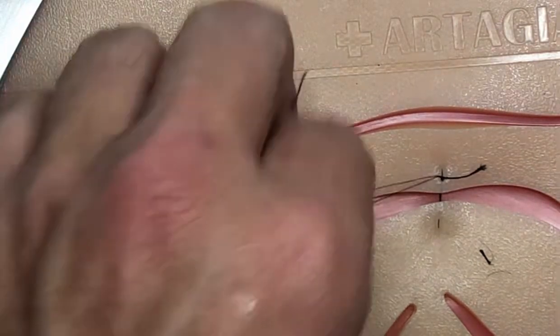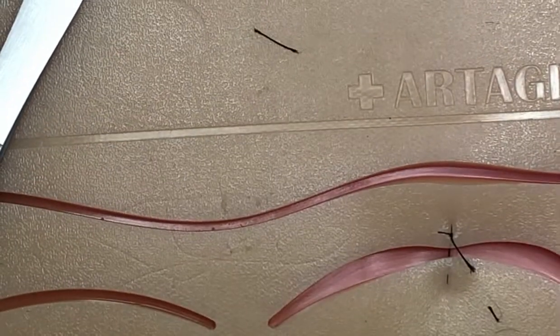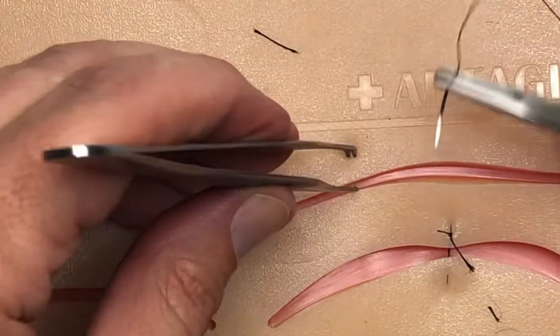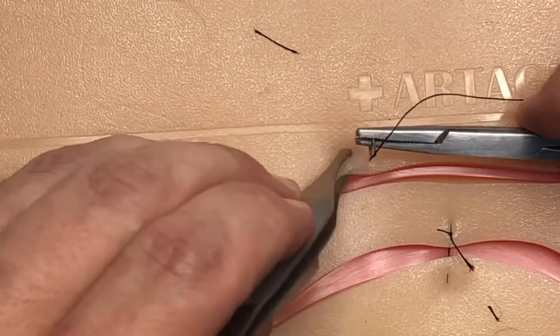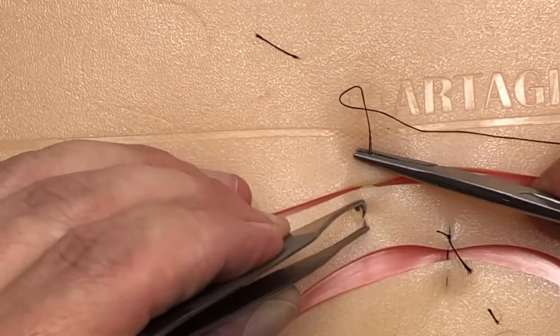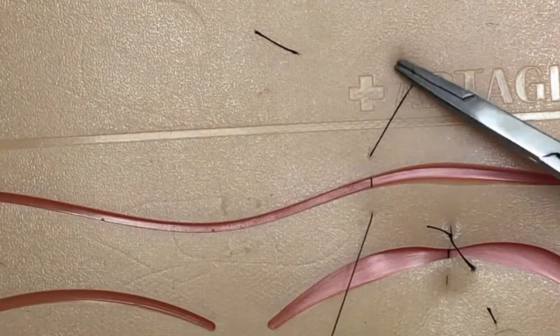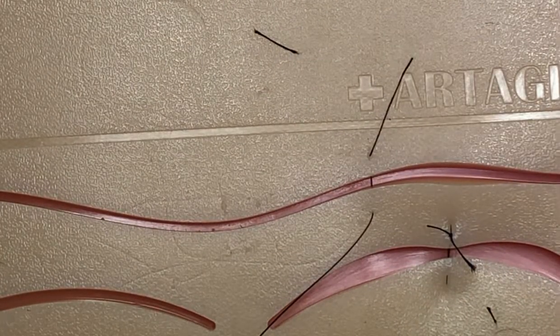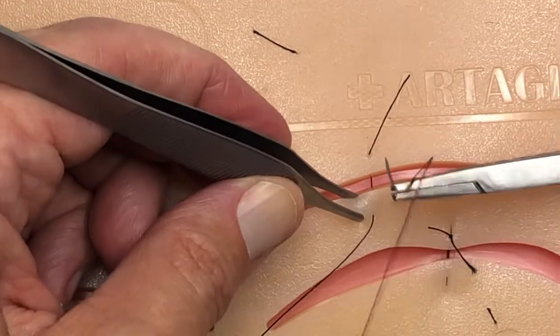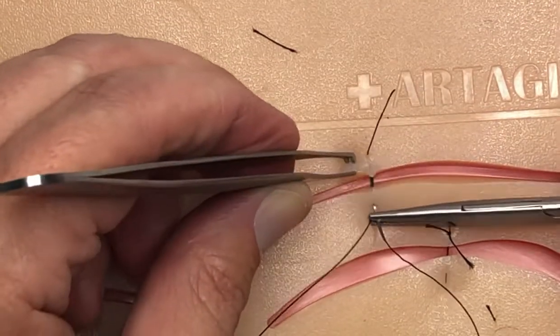I'm going to snip this and try that again on one of these areas where there is less tension, just to make it a little bit easier. We're going to get right up here and do a far deep and far, coming through — pull through — got our tail lying off to the side. Then we've reloaded the needle driver and we're coming right back through. We've got the far-far; now we're doing the near and the near.